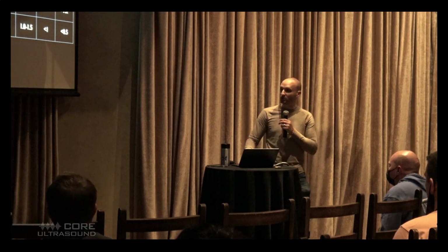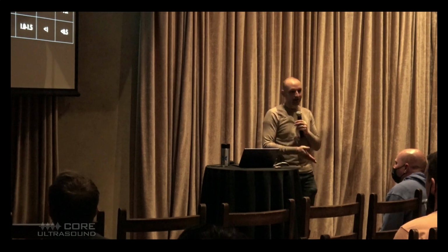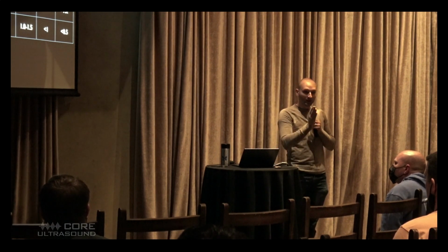Yes, sir. In the same slide, the continuous wave Doppler should be above the valve or just past the valve? Great question. So his question was the diamond of the continuous wave Doppler, where does it need to go, above or below? Pulse wave Doppler is the only one where the gate needs to be in a certain place. The continuous wave Doppler is actually measuring all the velocities along that line. So the diamond itself doesn't matter necessarily. You just got to make sure the line is going in the middle of the flow. You want it to be right in the laminar flow area. Great question. Any other questions?